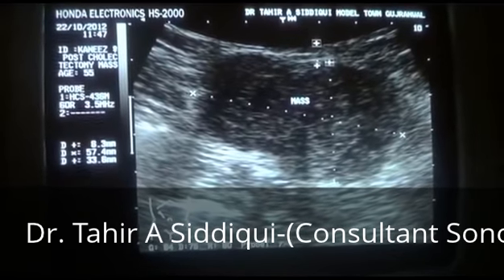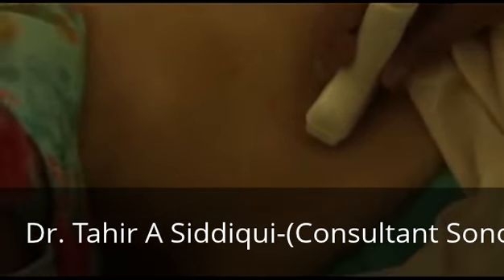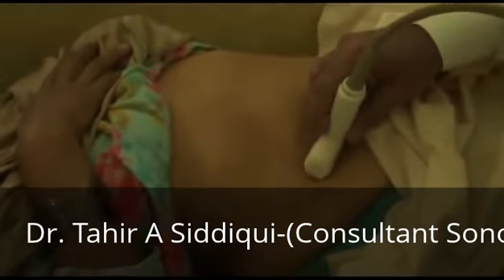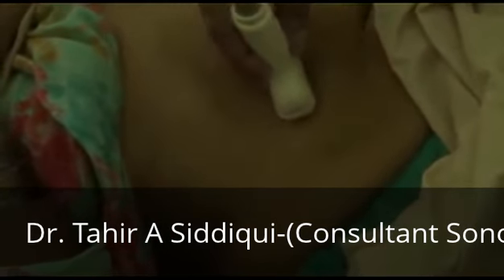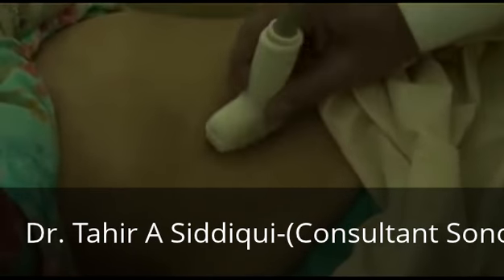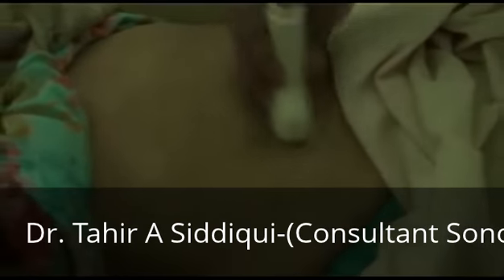Here, in this location, you see this is the location from where I am getting this mass. Now the initial mass was here. This is the first one, and then here is the extension, a second extension of the mass. So this is the area where the mass lies. Now let's see the mass.